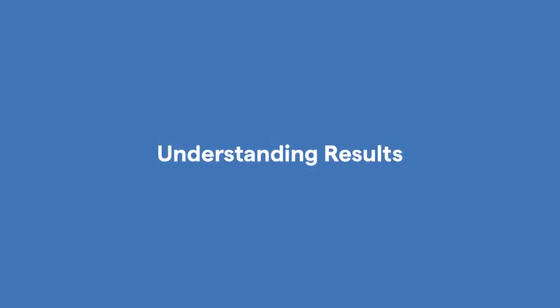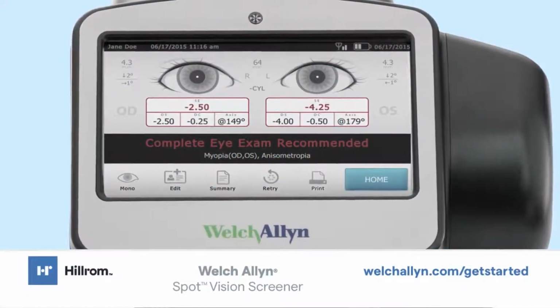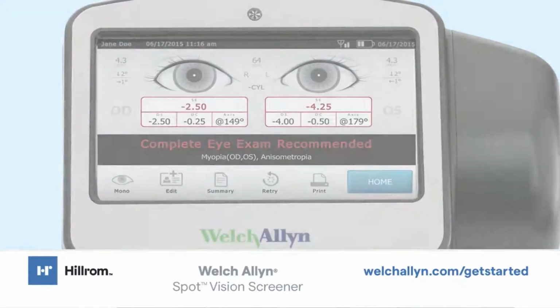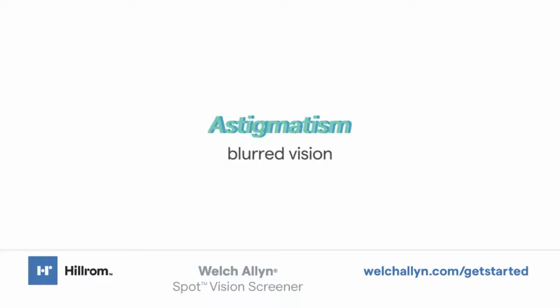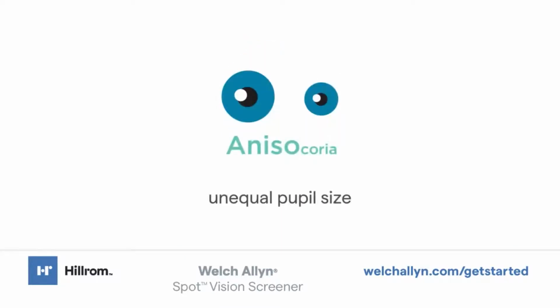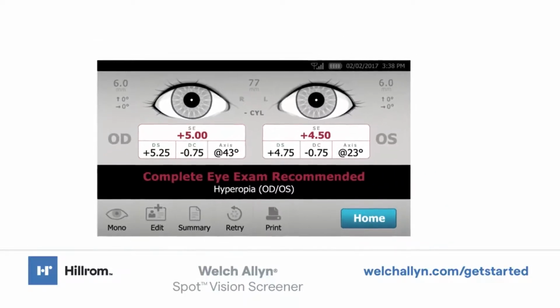Understanding results. Spot Vision Screener can screen for and detect 6 amblyopic risk factors in children as young as 6 months. Vision risk factors include myopia, nearsightedness, hyperopia, farsightedness, astigmatism, blurred vision, anisometropia, unequal refractive power, strabismus, eye misalignment, anisocoria, unequal pupil size. Spot Vision Screener provides instant on-screen data and a printed summary report to explain the conditions detected.